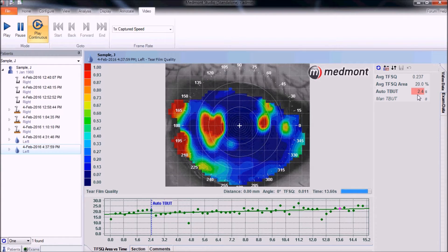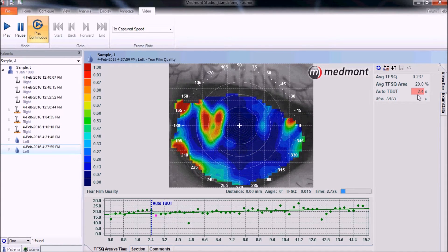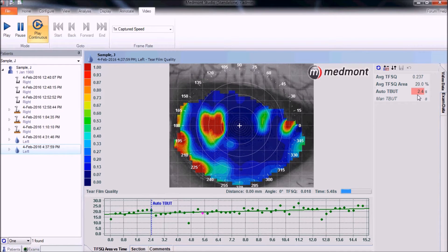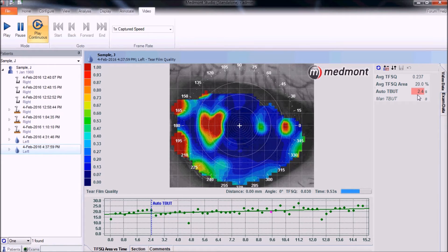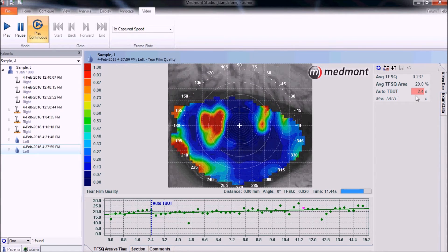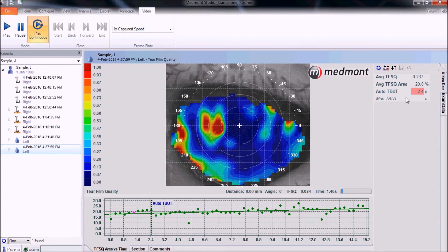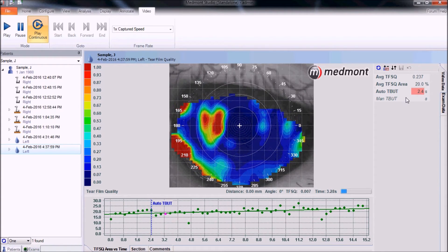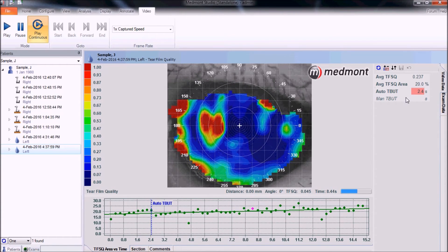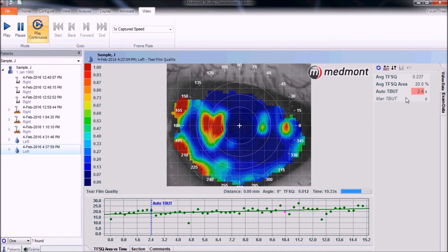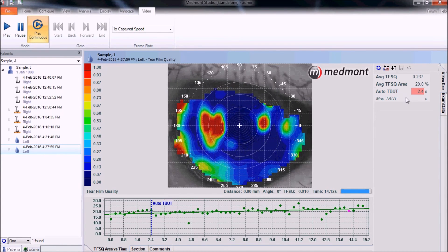This TFSQ analysis can be used to understand the degree of dry eye in a patient. It can be used between visits to track changes over time and to evaluate the effectiveness of treatments for the patient's dry eye condition. It is also a powerful tool both on the naked eye and over contact lenses themselves to assess the wettability of the lens plastics.